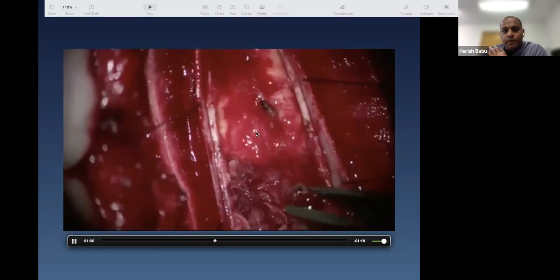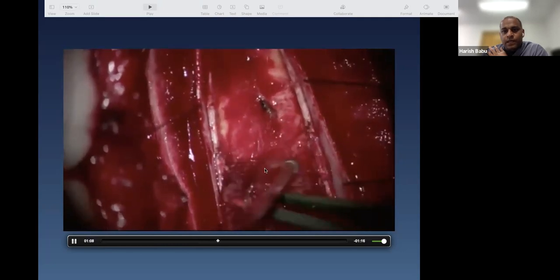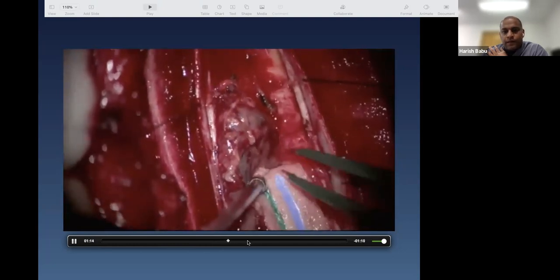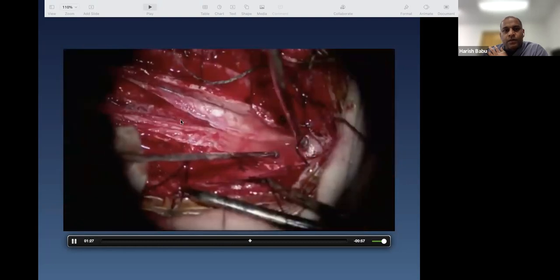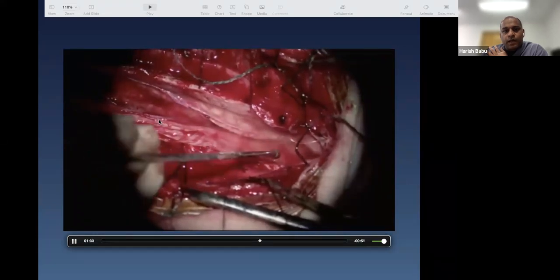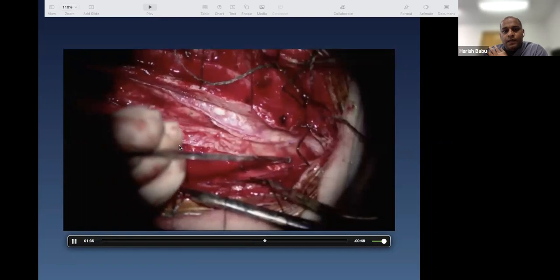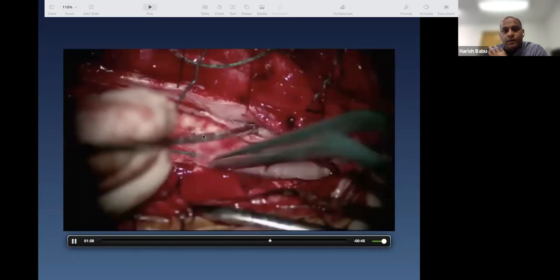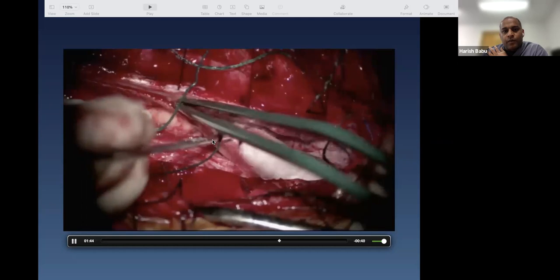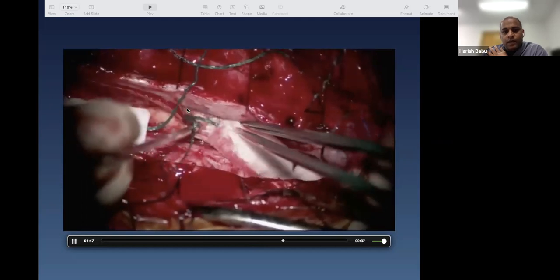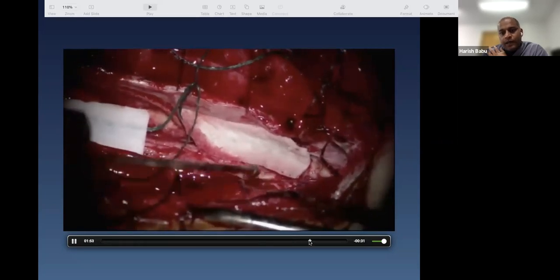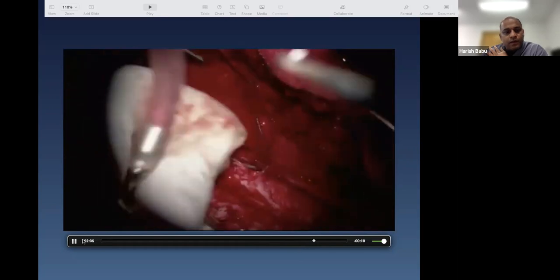A smaller ependymoma may come out in one piece; with a bigger one, because of attachments, you tend to debulk and truncate to make it safer. Once the tumor is out, you see what's left of the spinal cord — the myelotomy edges, the dura is still present, and the cavity left within the spinal cord by the tumor.